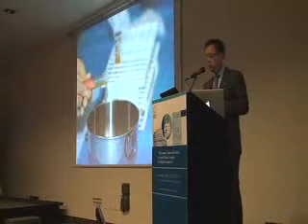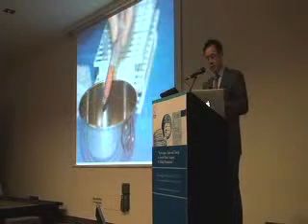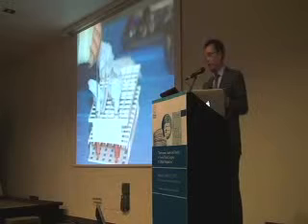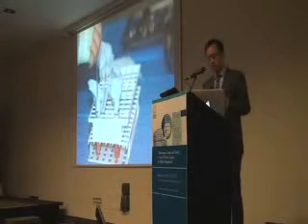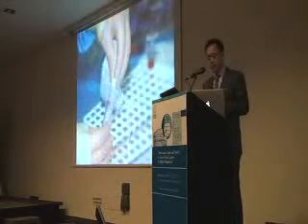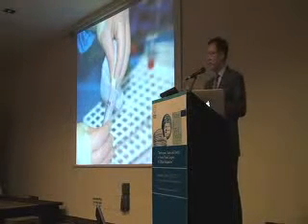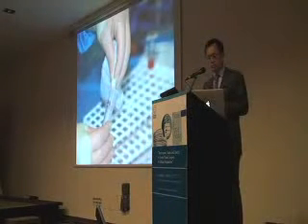You want to pour off the supernatant first. You never do the infranatant first, otherwise you won't get the top out. And then you let the infranatant drip out, and then you can knock out the oil. Just, you don't need to. I like to wick it for a couple minutes. The key thing is definitely don't cut the cotton fibers if you tuck it in there, because otherwise you're going to have foreign bodies. So definitely just stick it in there.